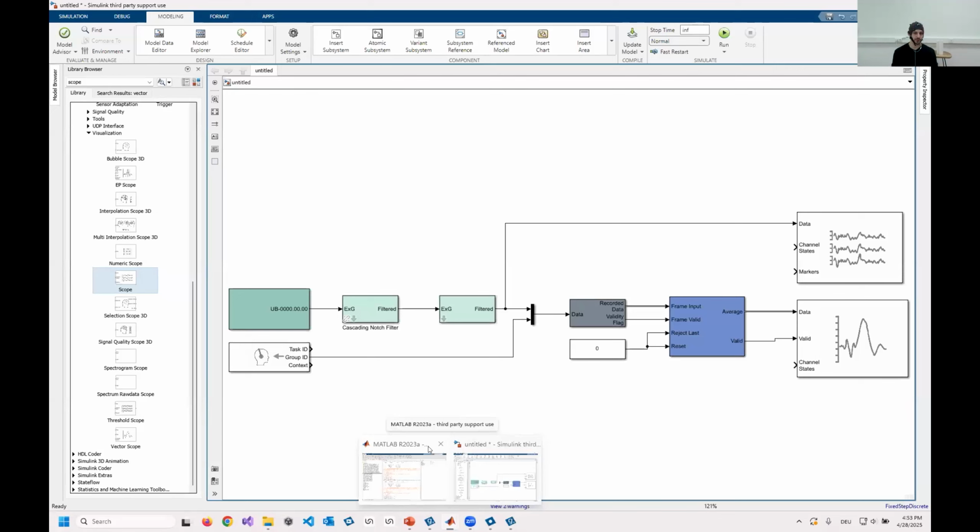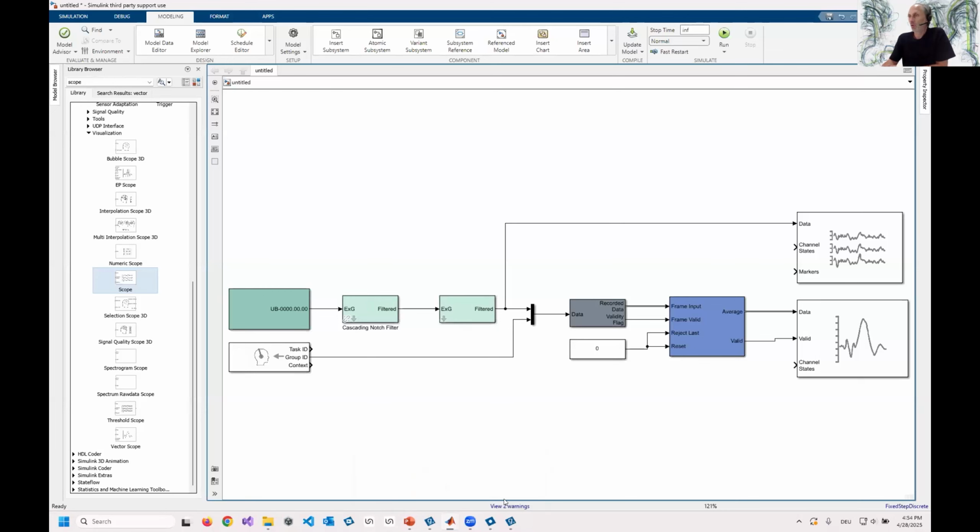And if you want to go more into research or higher sampling rates, higher amount of channels, I'd recommend to contact support and get some insights for the research amplifiers, or just take a look at the Spring School talks. Almost every amplifier will be there at some point. And of course, we have many scientific papers. So for all the different experiments, you can find some scientific references, including hardware, software, experimental paradigm, the analysis that was done, signal processing. So we have more than 300 of them that you can use as a resource.